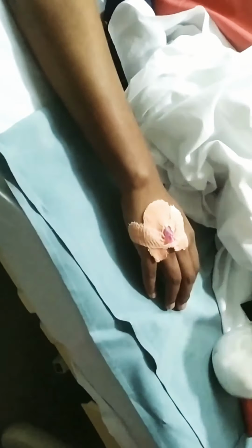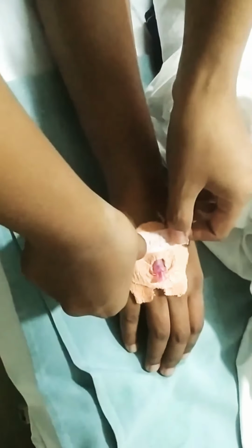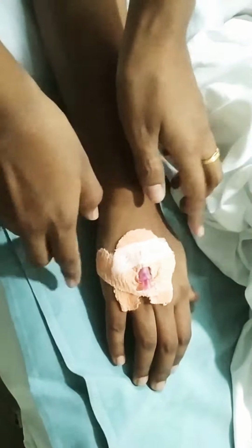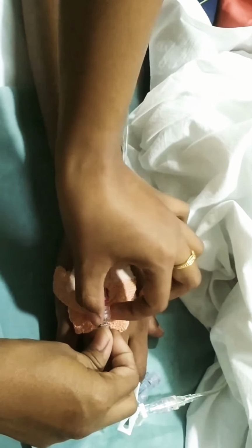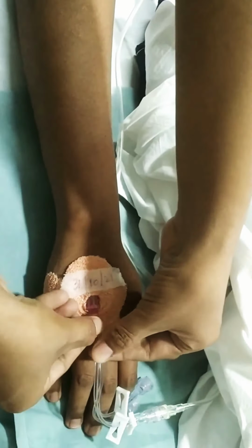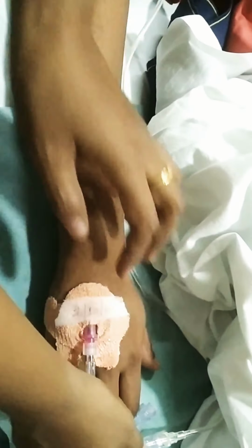Next step, you can also add a Triway or Q site to increase the ports for medication, and at a time you can give two or three medications. After doing all this procedure, discard the waste according to biomedical waste management, and that's it, your IV cannulization procedure is done.